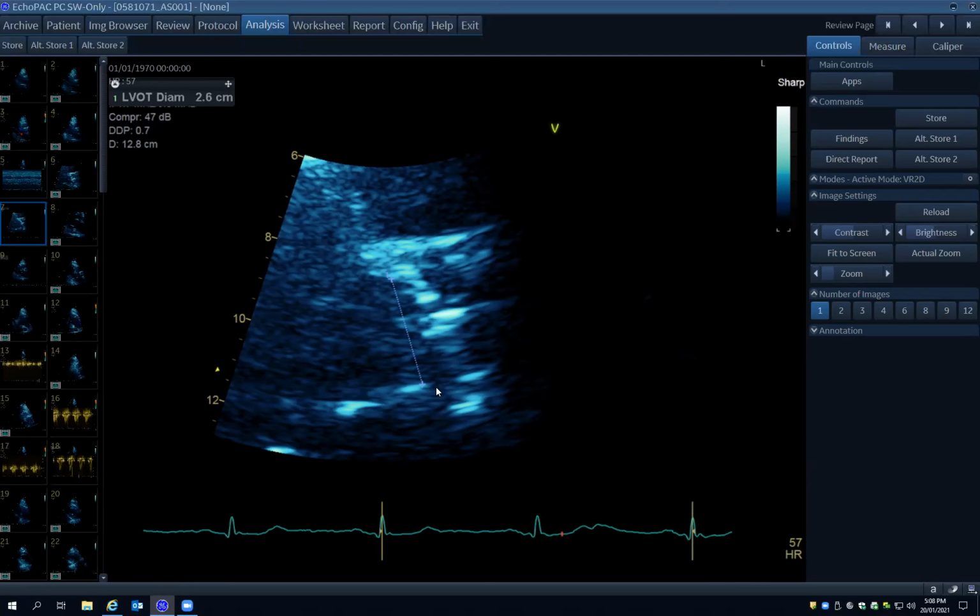So I would be looking to potentially go up a higher rib space, change your imaging around. And the other option you have, if you have a three-dimensional probe, is putting what we call X-plane if you're using Philips, or a multi-D slice through here. And what you'll often find is that our fundamental assumption that this is a circle is incorrect, but it's ellipsoid in nature. And you can get a better assessment of diameter, or actually trace the area out yourself.